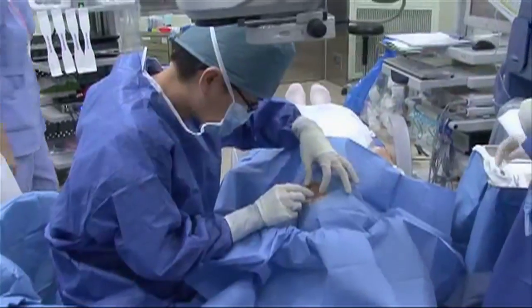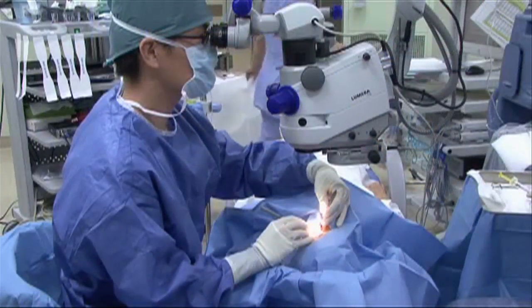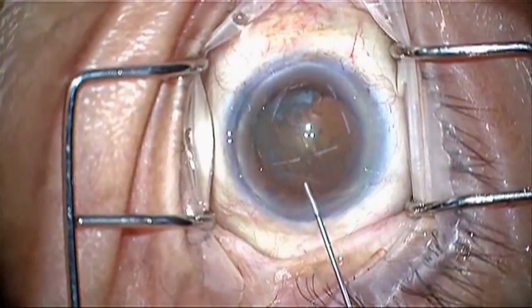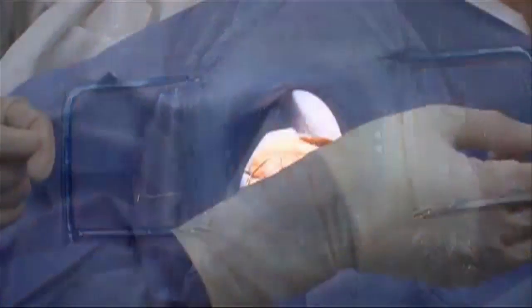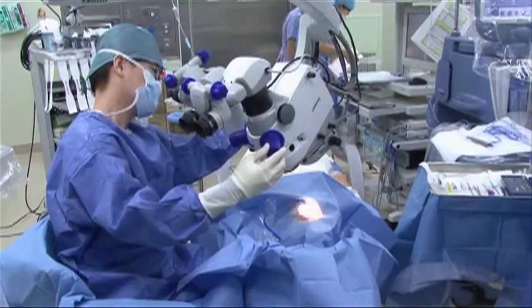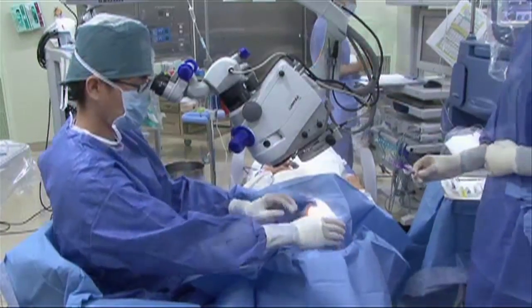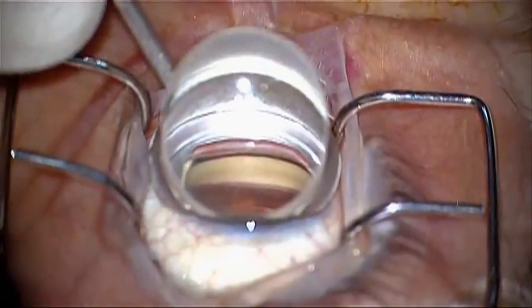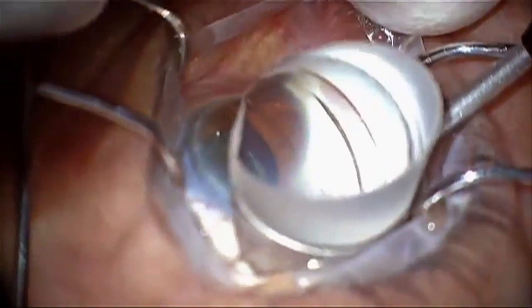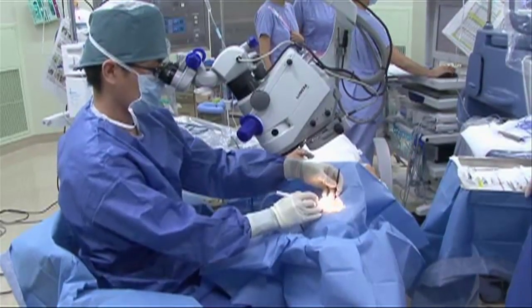The operating microscope — I'm amazed that we have Leicas downstairs and I love those scopes. One of the features I love is how easy it is to tilt the scope. In 2016, with other scopes you still literally have to crank and crank to get the microscope to tilt. It's cumbersome, but it's worth spending the extra time to get patient positioning and everything just right. Always keep in mind your own ergonomics — make sure you're not in an awkward position. Take the time, make sure you're comfortable. Your first several cases are going to take longer, and the longer they take you're going to fatigue, so being comfortable helps.